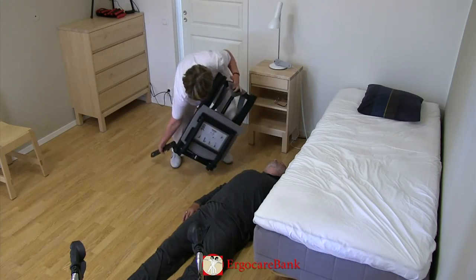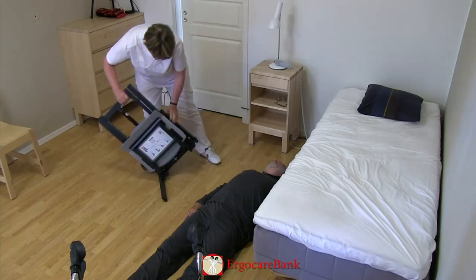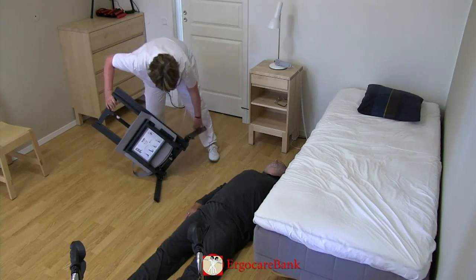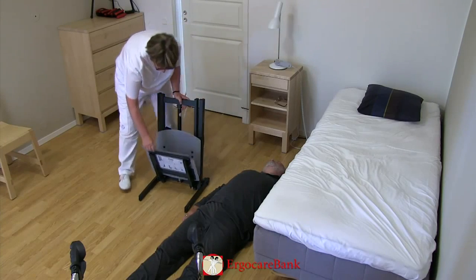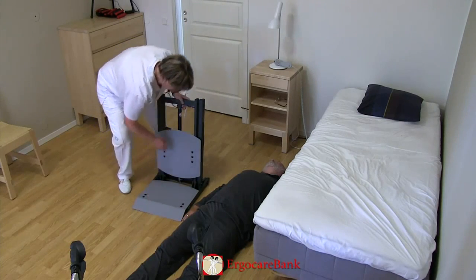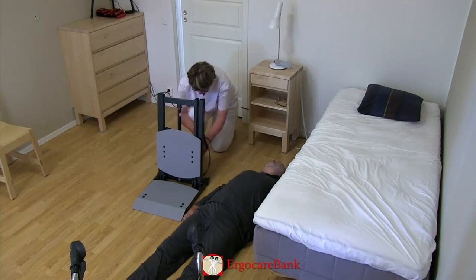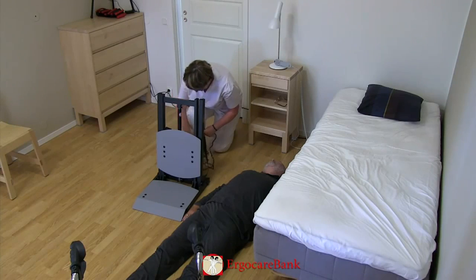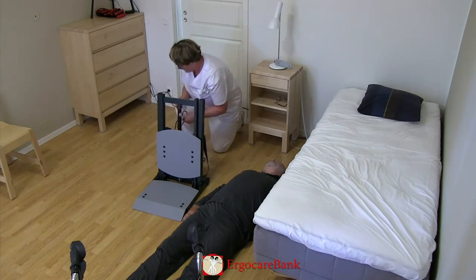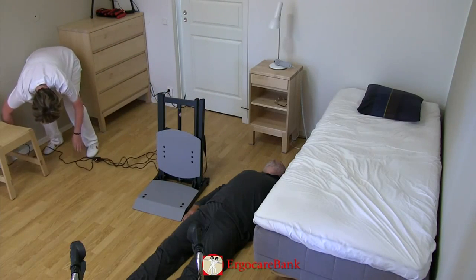The stand-up is mounted by folding out the legs, putting down the seat, and plugging in the electric cord in the wall socket.